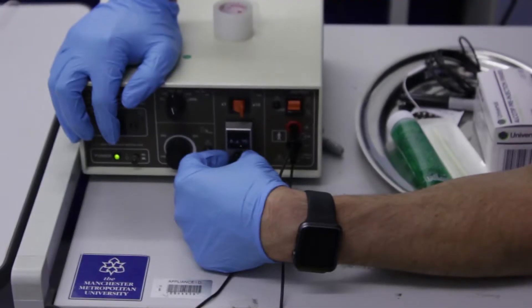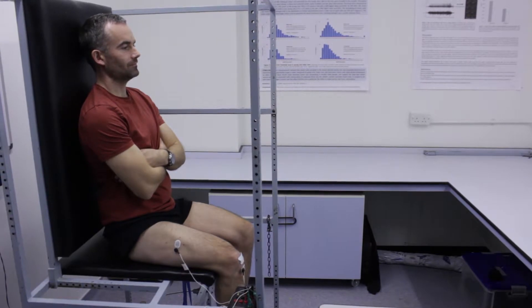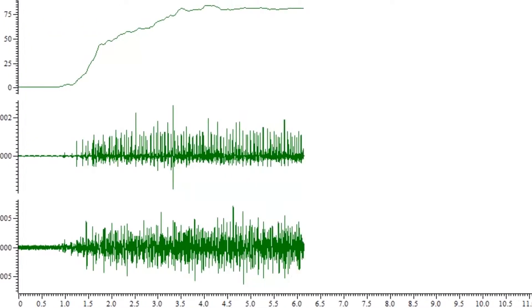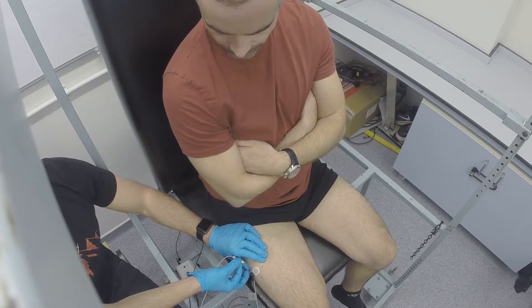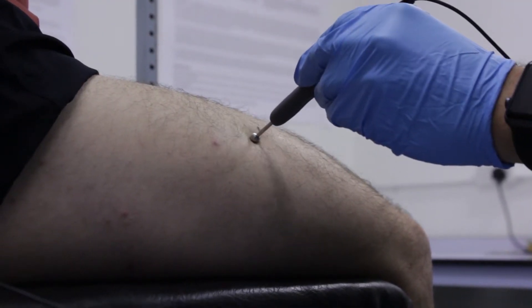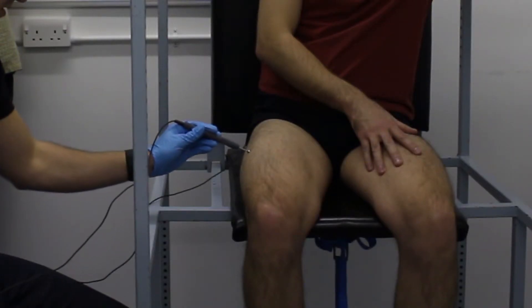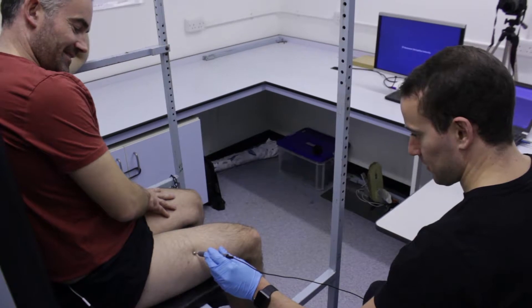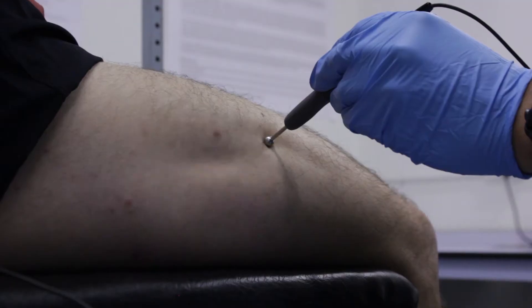In these tests we will use surface and intramuscular electromyography, commonly known as EMG. This measures electrical activity from the muscle and can be used to estimate motor unit number, size, firing rates and stability. The EMG measurements will be taken from around the motor point of the Vastus Lateralis, which can be found by applying very low current electrical stimulation over the skin. We are looking for the area of muscle that makes the largest twitch from the lowest stimulation.